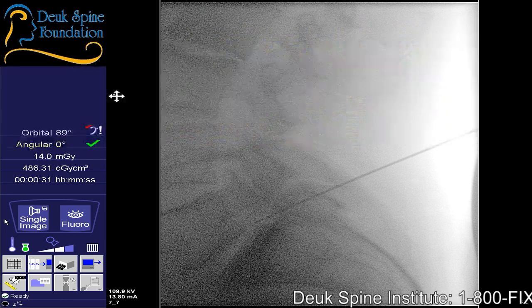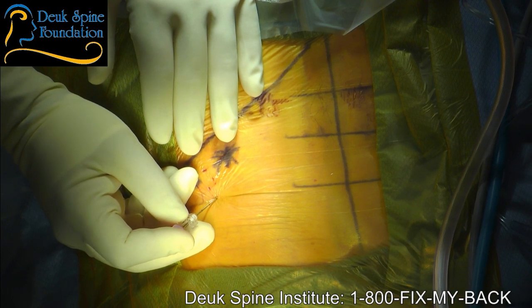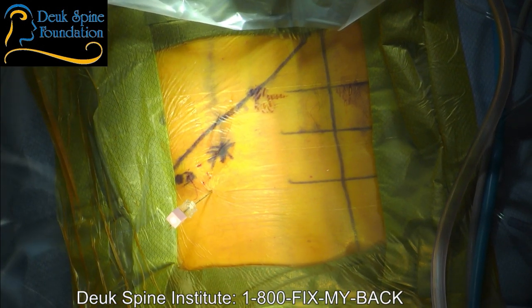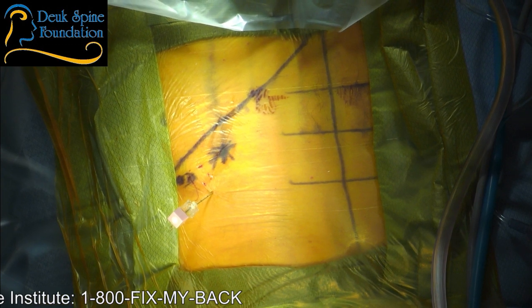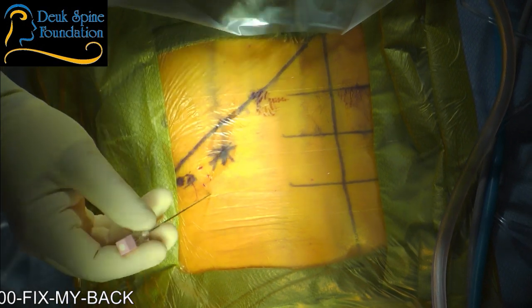Are you feeling anything at all? Where? But it went down your leg. Down your leg. Okay, that's what I needed to know. I'm gonna have to come a little steeper.